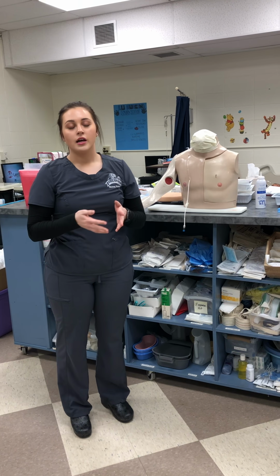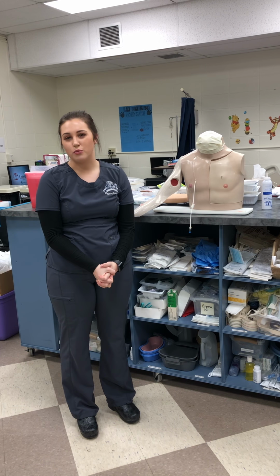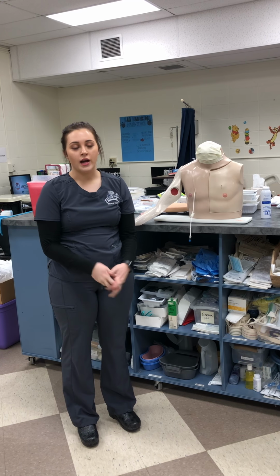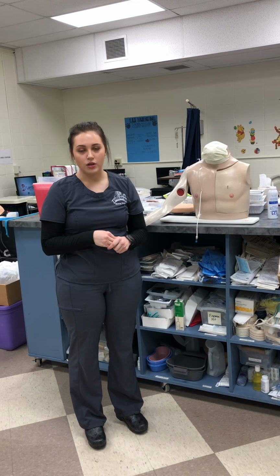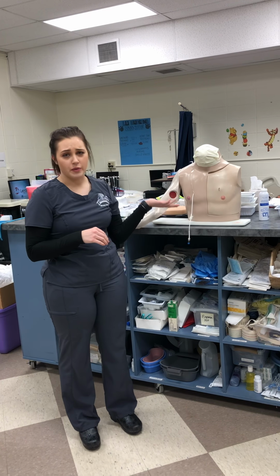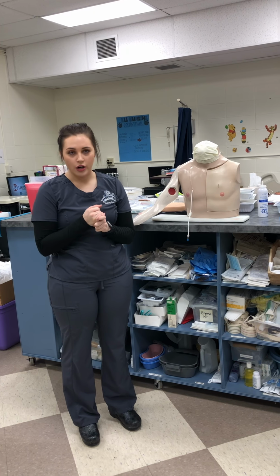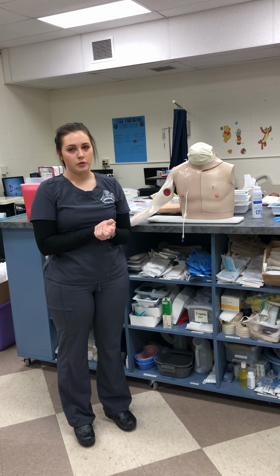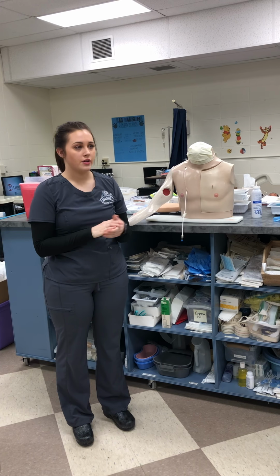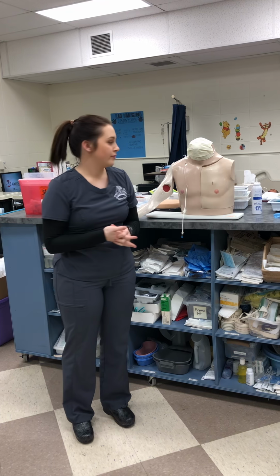So what I'm going to do is make sure that my patient understands what we're going to be doing. Typically, if they have a port, they're probably pretty used to this kind of thing. So I'll explain why we're accessing it and what the procedure is. I've introduced myself to the patient. I've washed my hands good and clean with soapy hot water, and I've provided my patient privacy. So now I'm going to go ahead and go into my patient's room, and we're going to start the procedure.